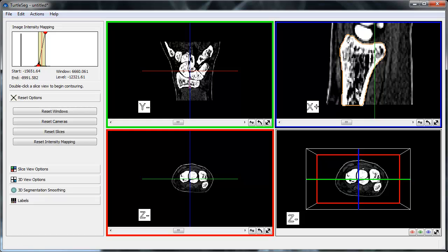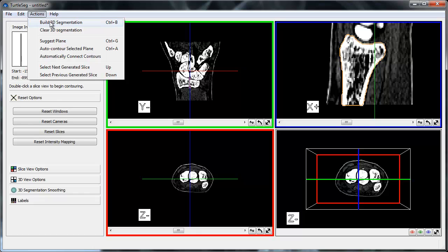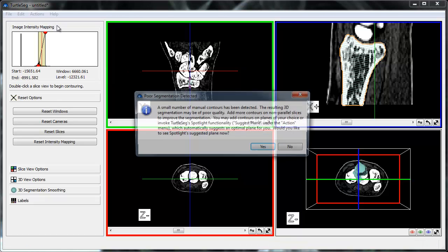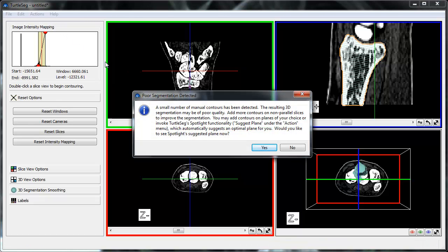With this single contour, we can now attempt to automatically construct a 3D segmentation of our object. We do so by going to the Actions menu and choosing Build 3D Segmentation.